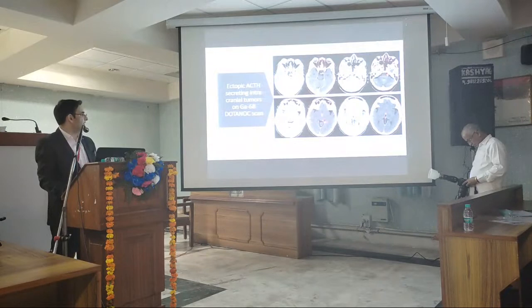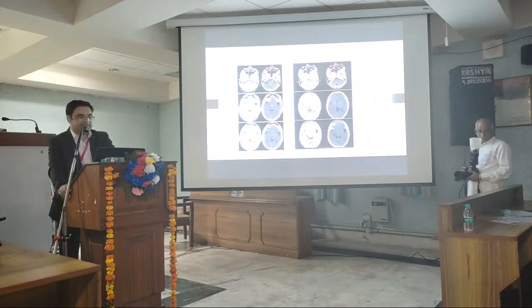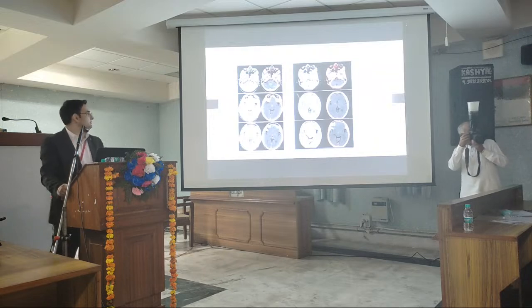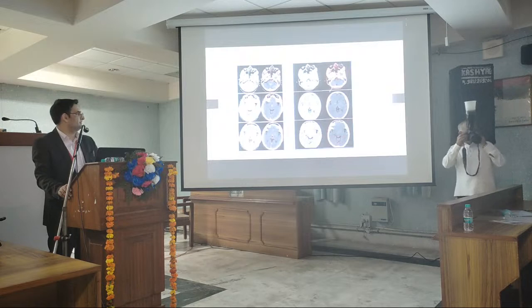Another patient had an unusual site of ectopic ACTH tumor, with multiple sites not amenable to surgery. So we went forward with PRRT, that is peptide receptor radioligand therapy, with lutetium-177. This is the baseline scan and this is the post-therapy scan. Then we see the resolution of the lesions.